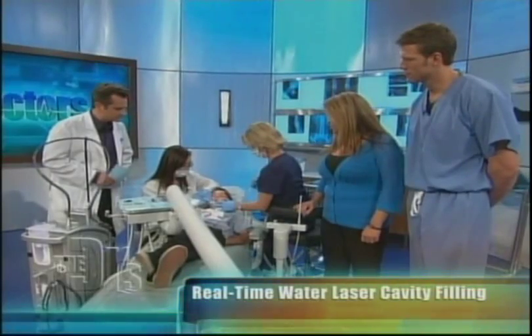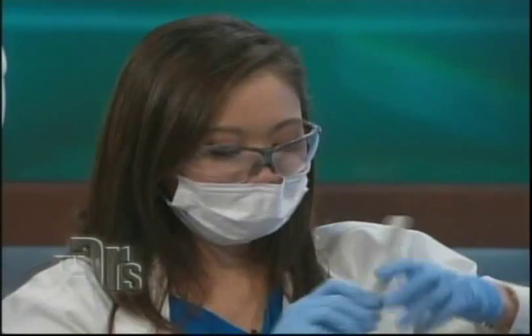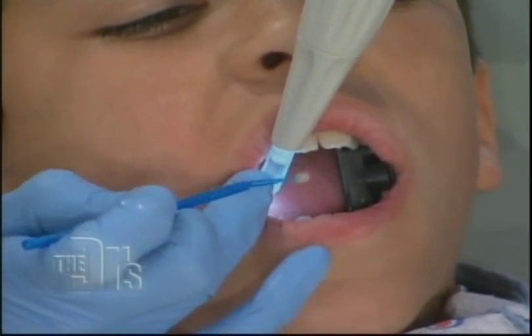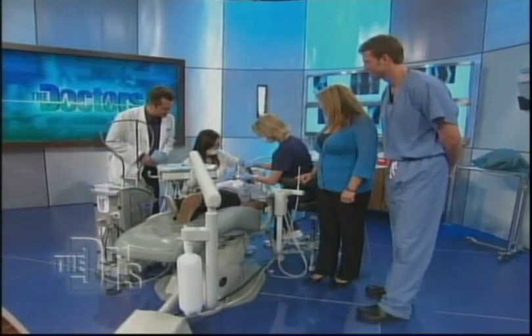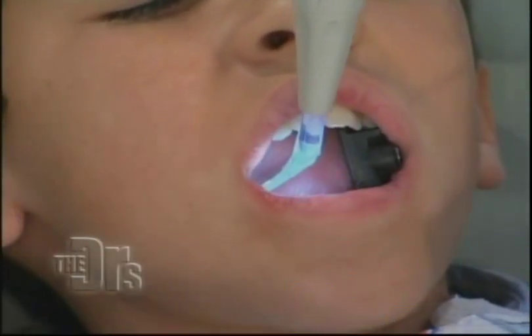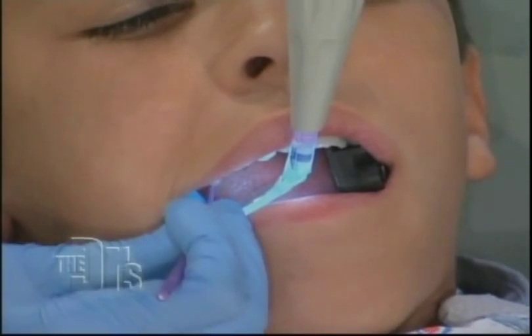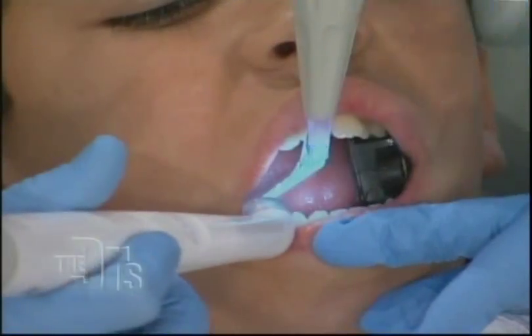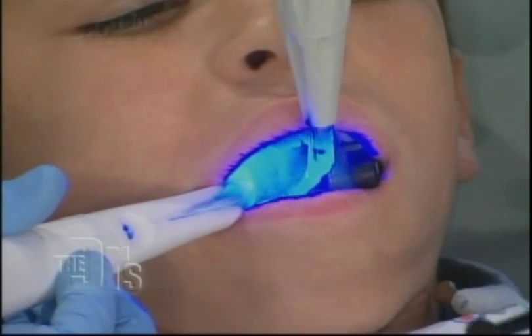The second layer is called the prime. The prime prepares the tooth structure to receive the composite resin. In the past, dentists used a lot of material called the silver filling — the amalgam, those old ugly silver fillings. Now we're priming it. The next layer is called bond — it's like a glue that attaches the composite resin to the tooth structure. We also have something we call the magic light: it's a blue light that hardens the tooth surface. The composite resin starts off as a putty, very liquid-like, and then with the magic light, it hardens up.